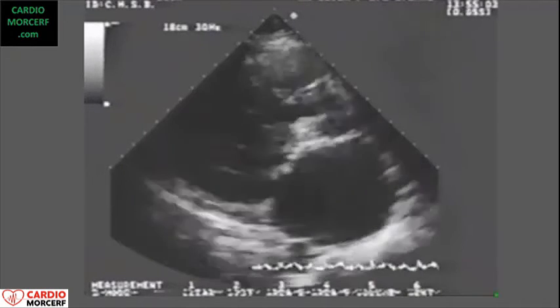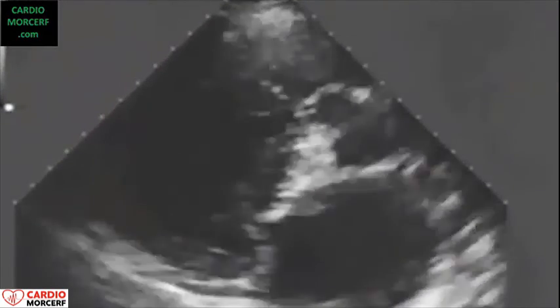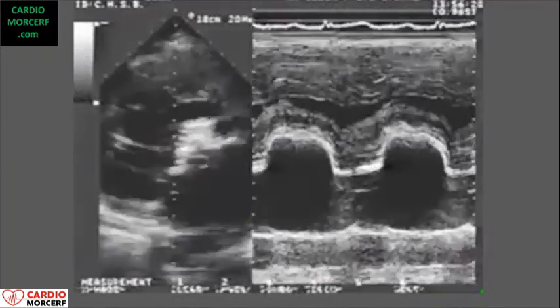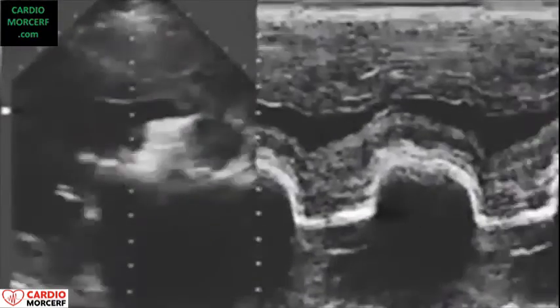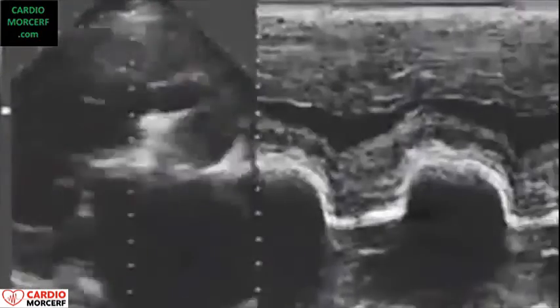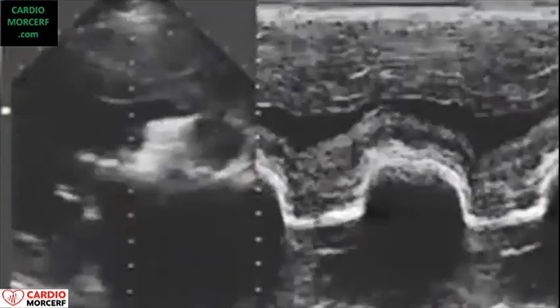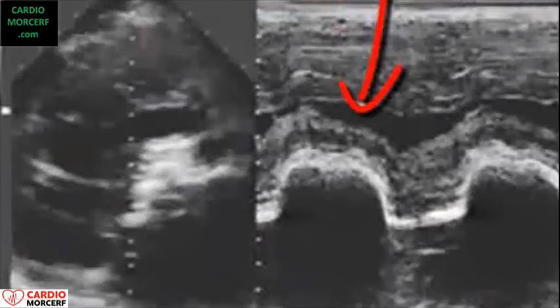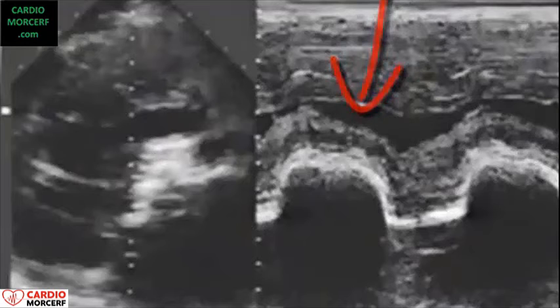Look at this patient. It looks like a calcified rheumatic aortic and mitral valve. Now let's aim the cursor at the left ventricular outflow reaching the aorta and base of the mitral valve. What we see is this well delineated border of the echo from the base of the mitral valve and a large vegetation with its smudge appearance that we did not identify by 2D echo because we thought it was a calcification in the aortic valve and not a large vegetation, well demonstrated by M mode.